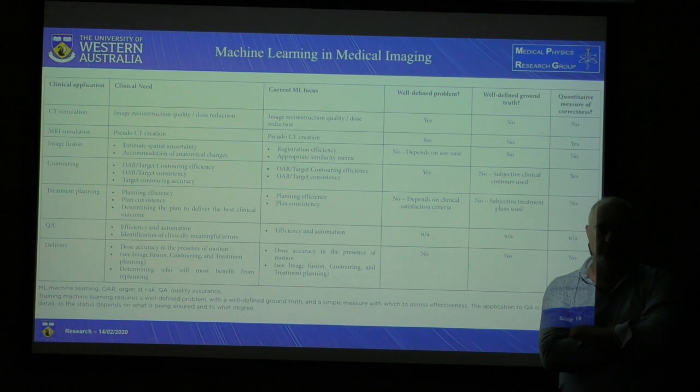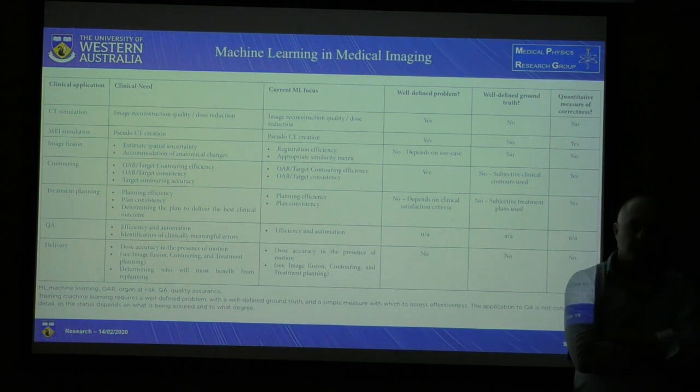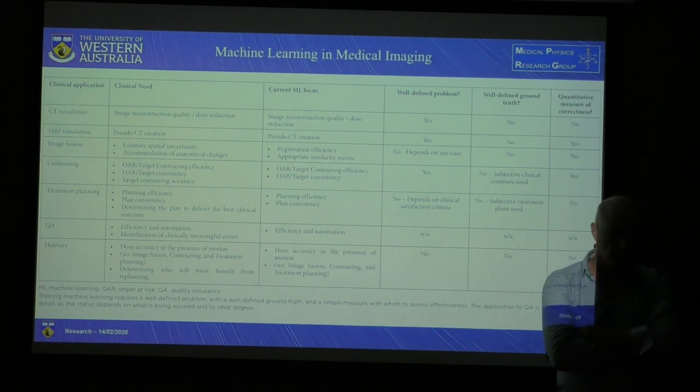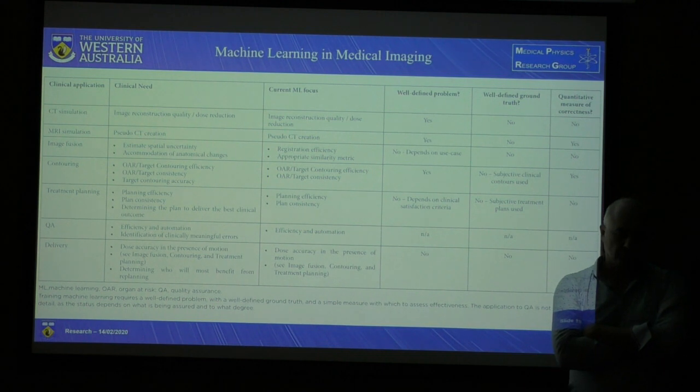Do you know if they also compared just the scans, the CT scans? They actually didn't. That's what the previous study did, two slides before, Zhao Han, using a different machine learning model. They just compared the pixel values, the Hounsfield units. But this one took it a step further and actually saw whether once you apply the plan, there should be even more error that comes out of it.